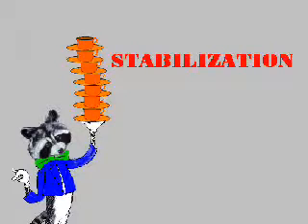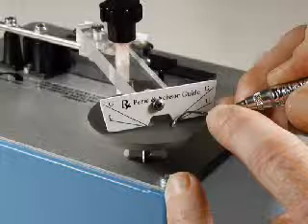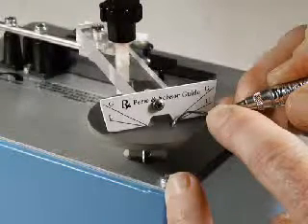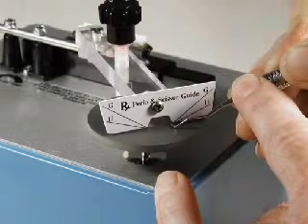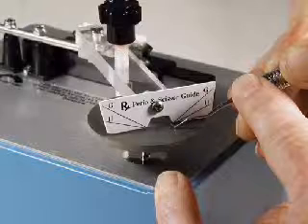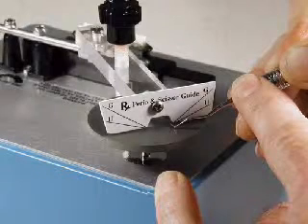For stabilization, rest your hands against the machine's table top or side. Use both hands to support the instrument close to the point of contact with the abrasive. If the instrument tends to move when the machine is activated, try the following: use lighter pressure or grasp the instrument more firmly.